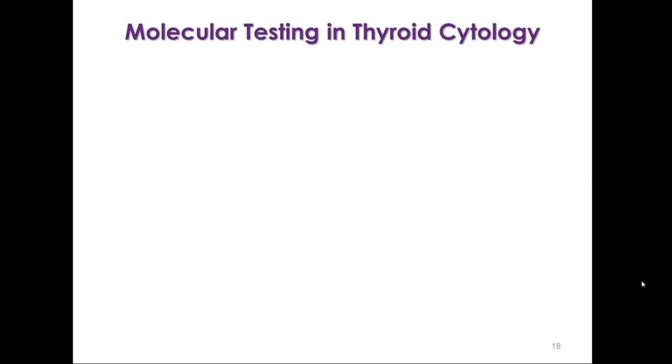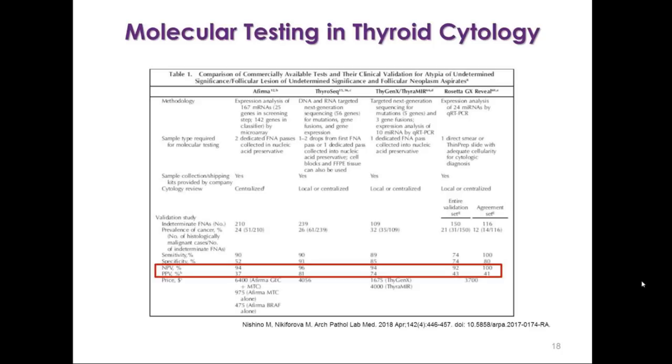So let's take a look at molecular testing in thyroid cytology. Again, there are multiple commercially available molecular tests that are being performed on thyroid cytology.